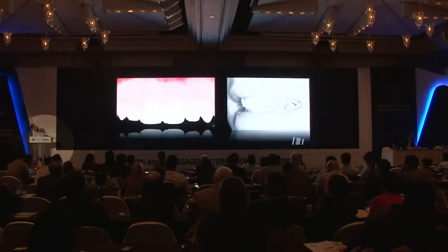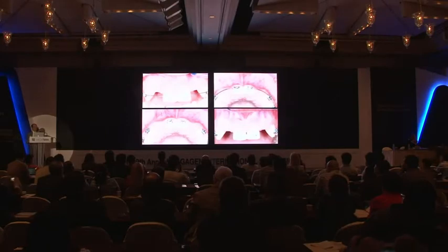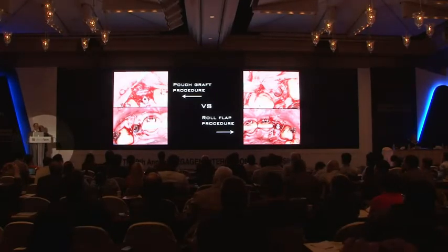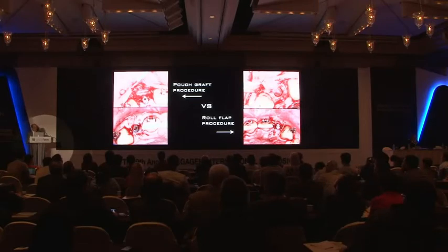The follow-up after 7 years. Another case after the orthodontic therapy where we inserted the implant close to the teeth. I inserted the implant with immediate loading and made a soft tissue augmentation at the same time. On the left is a pouch graft, and on the right, a roll technique, trying to increase the width of the tissue.